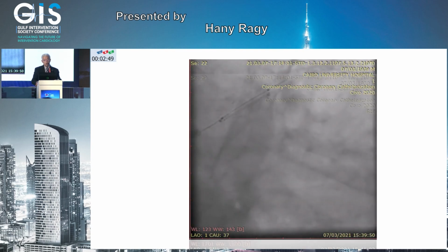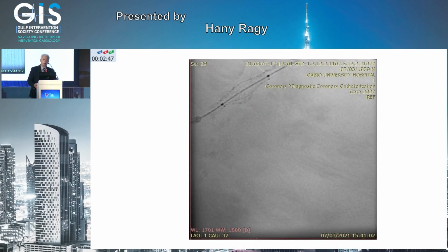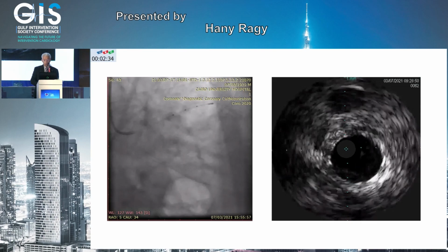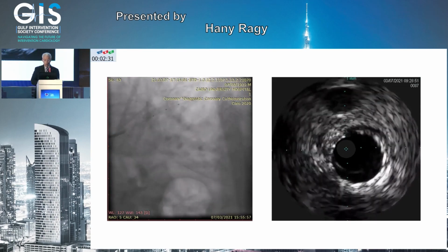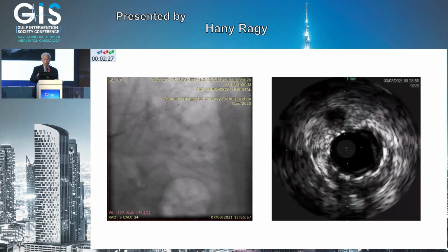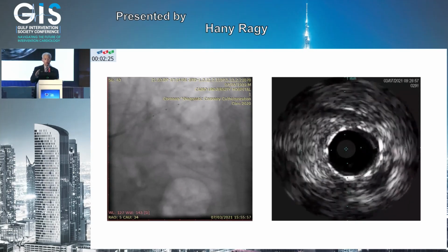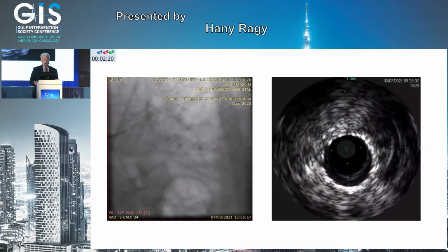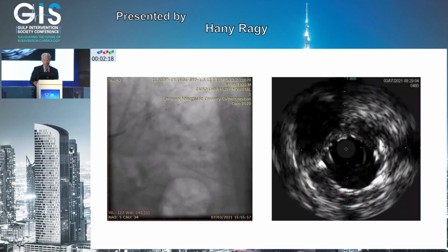This patient received a self-expanding stent. The area in the middle of the aneurysm was post-dilated anyway, but the stent grew into the aneurysm. So the IVUS afterwards looked really pretty. You'll see here on the right where the stent really grows in the aneurysm and opposes the wall all through. And this patient did extremely well. The left main was then done by standard stenting.